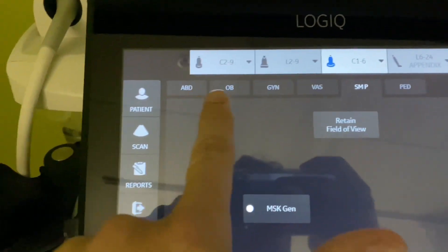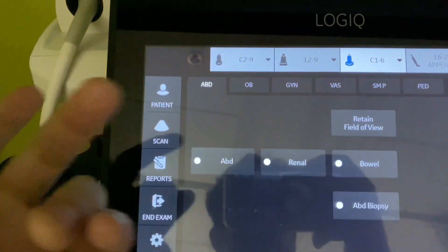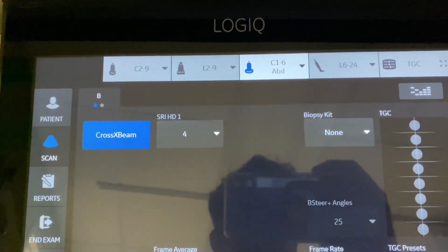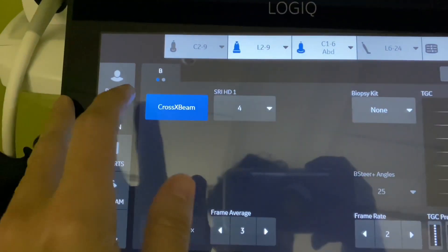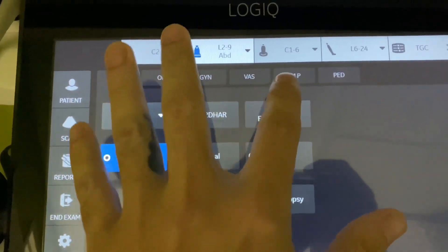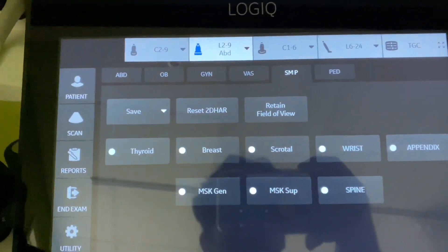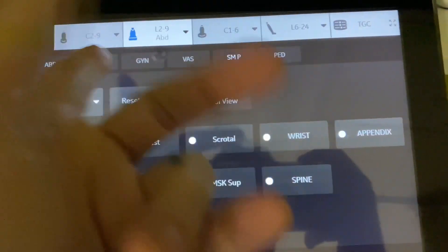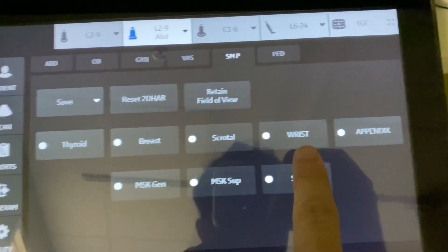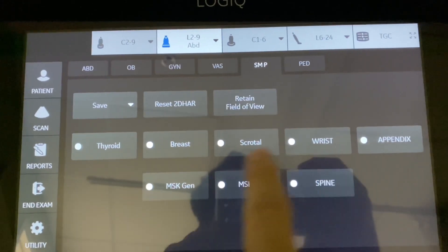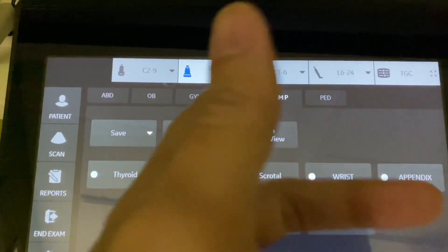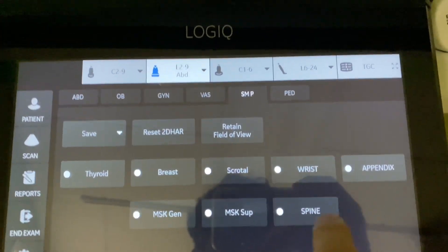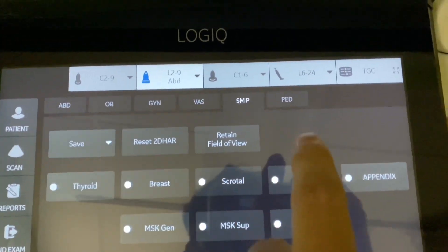We use abdomen, obviously abdomen, and then abdomen. And we also have a section there for bowel. If you're using this one, you can choose your maybe musculoskeletal settings. We use that one always for appendix. The L9 for appendix is always, so I'm going to use that one for appendixes too. So we have appendix, as you see. You have other things there: wrist, scrotal. Now I would only use that for a scrotal that's very swollen or a lot of edema, but for a regular scrotal you use the 15.